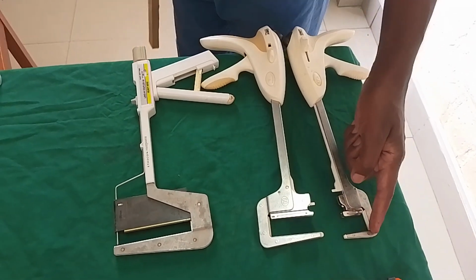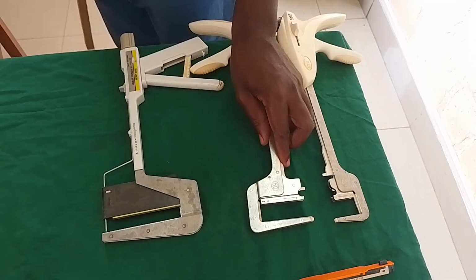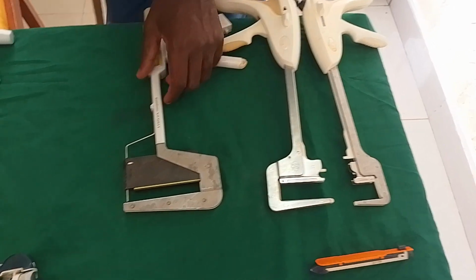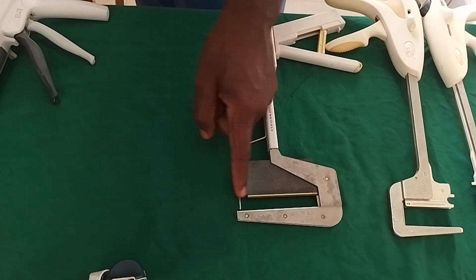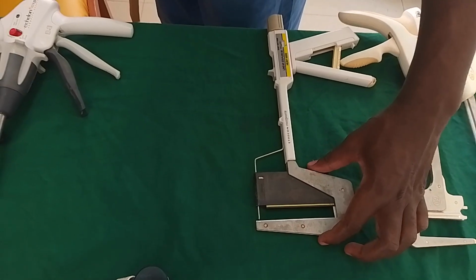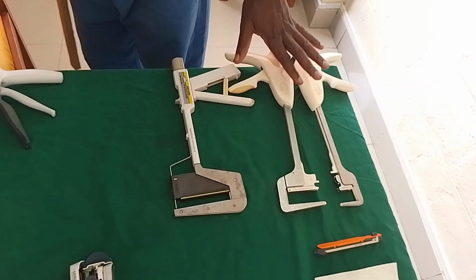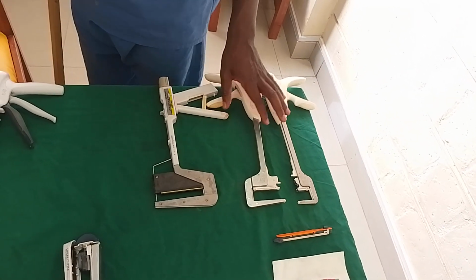This one shows us the length of the tissue. This is a 60 TA. This one also shows us the length of the tissue. This is a TA 90. It also shows us the length of the tissue that the staple can accommodate. So these ones are used when we are doing transverse anastomosis.